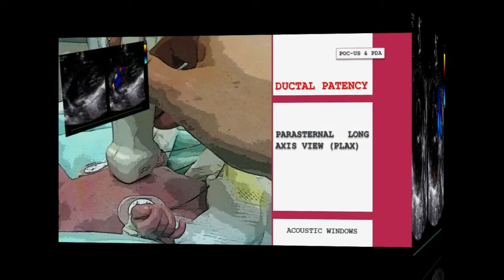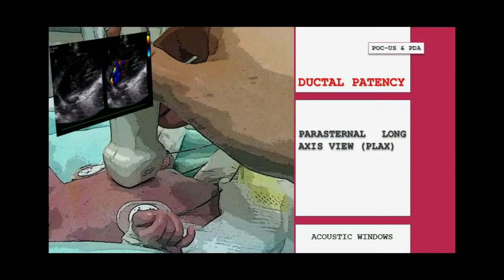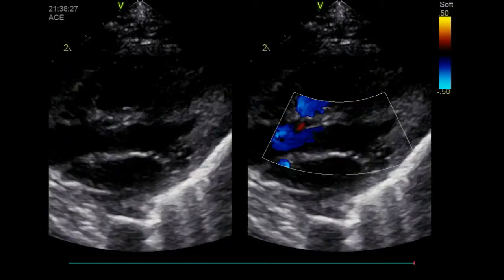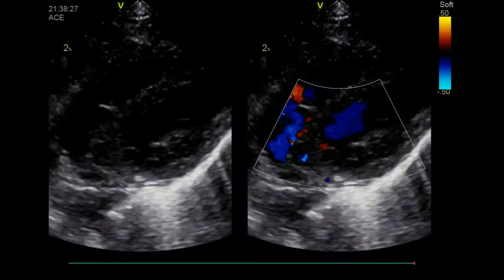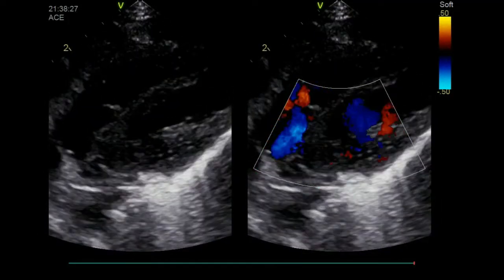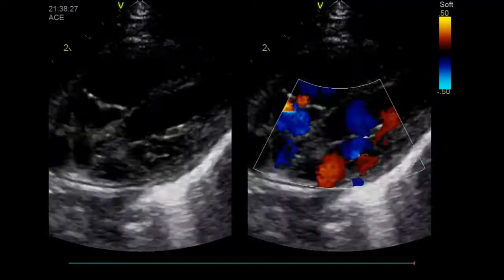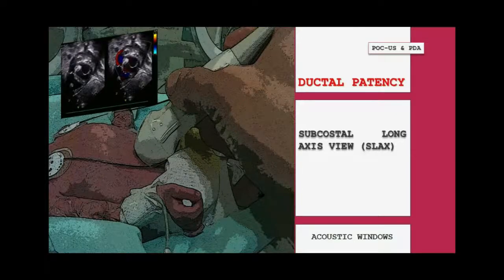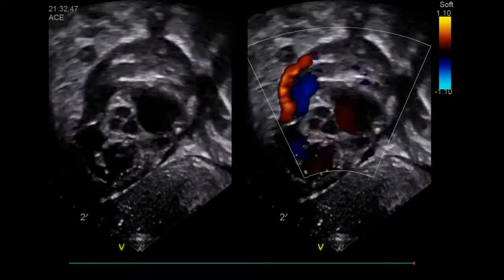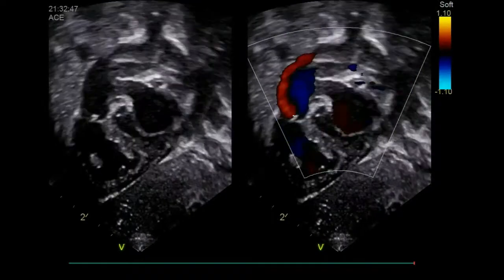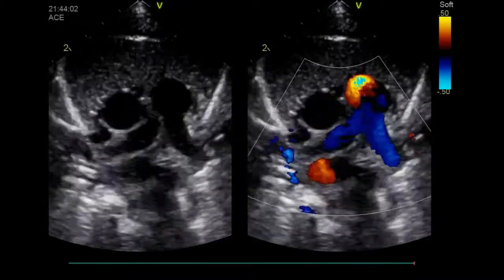Besides the short axis and suprasternal views, it is also possible to see the DA in the parasternal long axis view by moving the probe anteriorly toward the pulmonary artery. The subcostal and the left high parasternal long axis views also allow the detection of the DA.